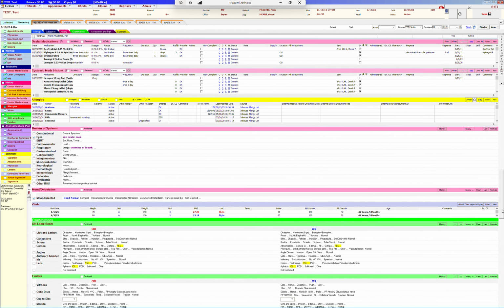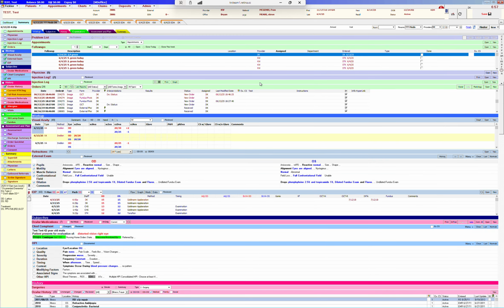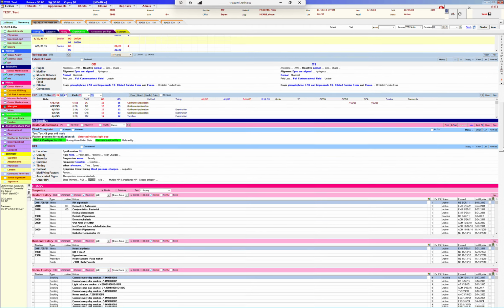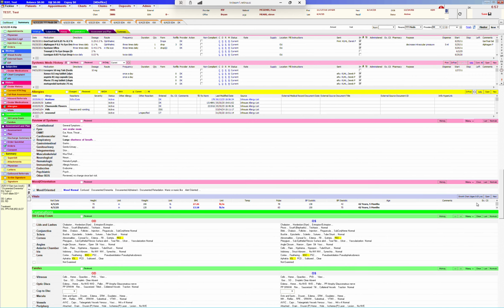At this point, you want to put the blood pressure cuff on the patient and get their blood pressure to be entered here. While that blood pressure cuff is running, you want to go back through the chart and make sure that you filled everything out, that you have your orders, your vision, your pressures, that all these parts of the chart you didn't skip over and you caught everything. So this gives you a couple minutes while this is running.